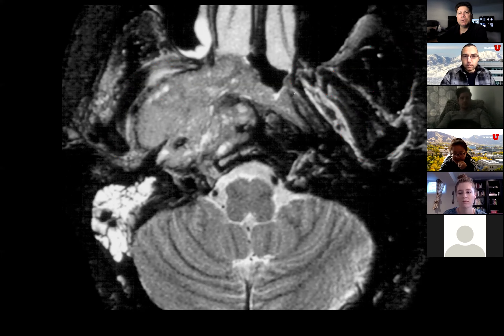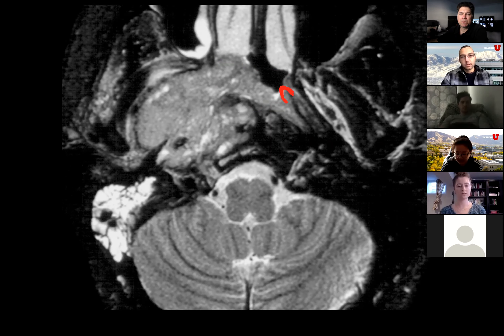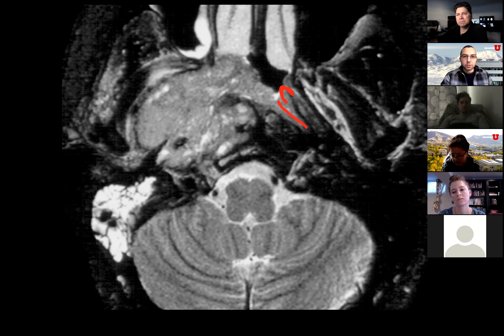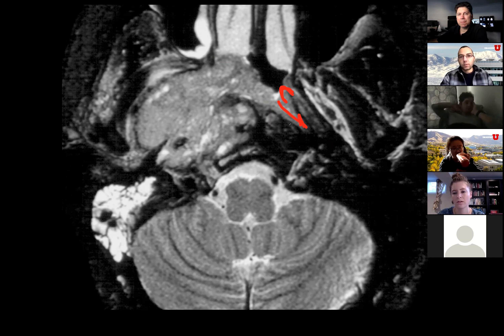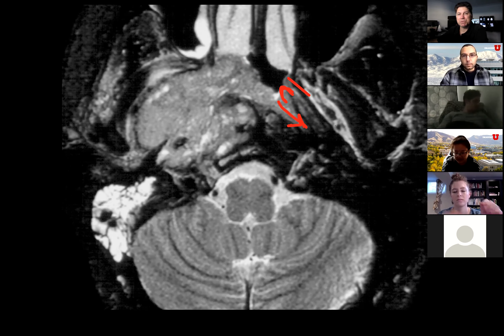What level are we at up here? Do you know what this bump is? That's the torus tubarius. And behind the torus tubarius — there is a recess of the pharynx that goes out laterally. The fossa of Rosenmüller, if you like to name stuff after dead people.